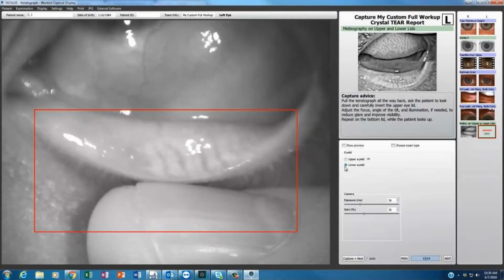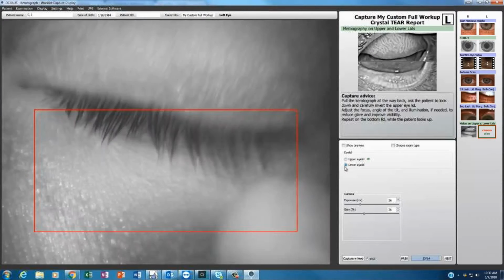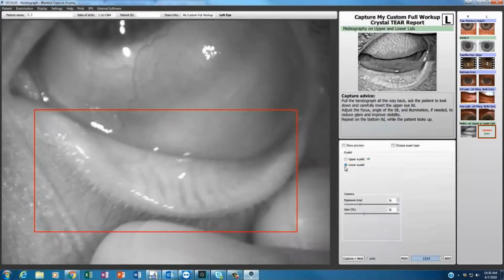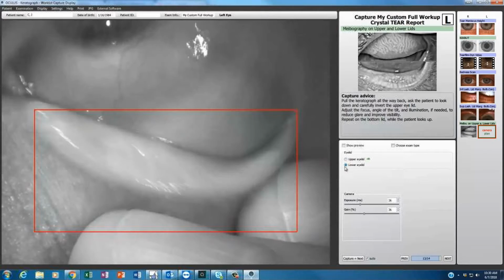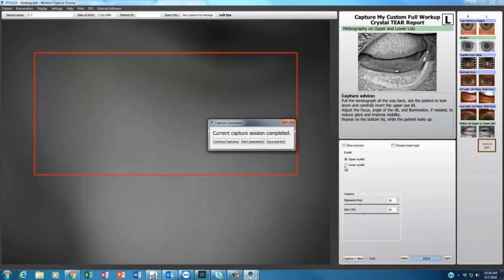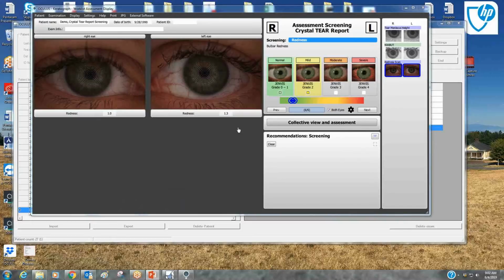Really making sure that if it's having them do a left eye image, they're paying attention to that it's the left eye image. We have problems with that right now. They do one and then they do the other, but that's not the way the machine wants them to do it. So when we try to do it, and it's like, you're going to view the right eye or the upper lid or the lower lid, and then you go to compare it to something and it's wrong. You can't compare it right because it's the wrong thing. So just this screen or this little message box.